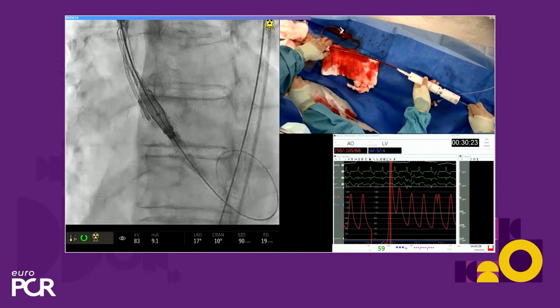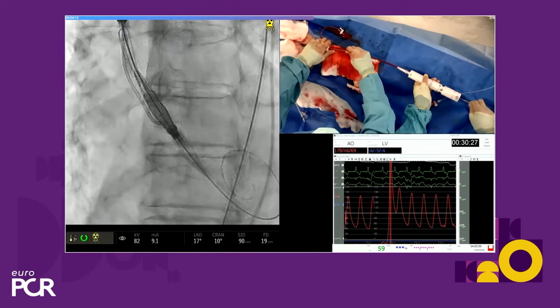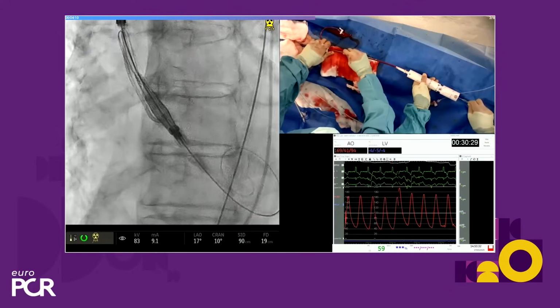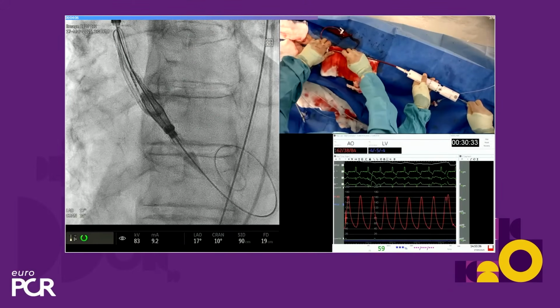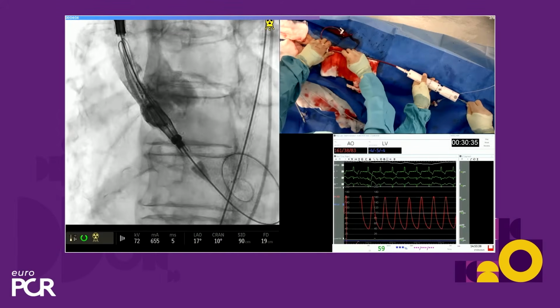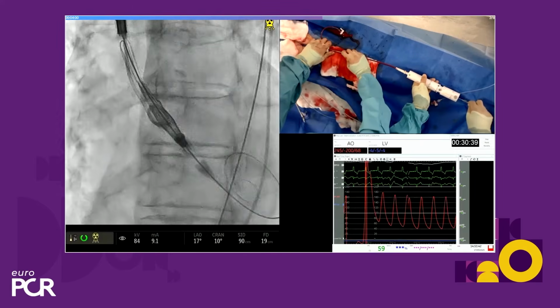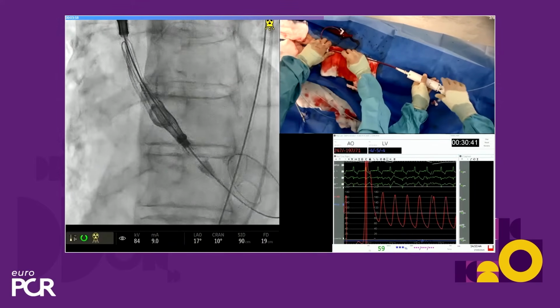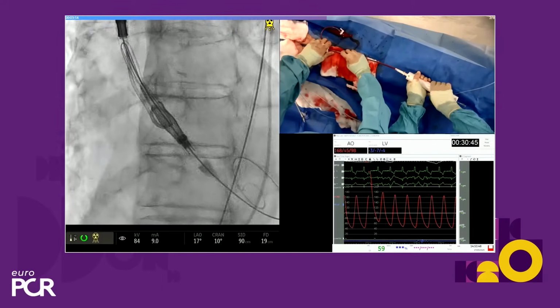If the pigtail's at the bottom, that'll serve as a great marker, but it's very important to ensure that you get that marker right at the bottom, and that as the first operator, you're always having a forward pressure, always forward when you're placing.